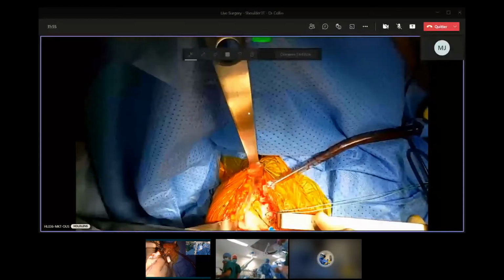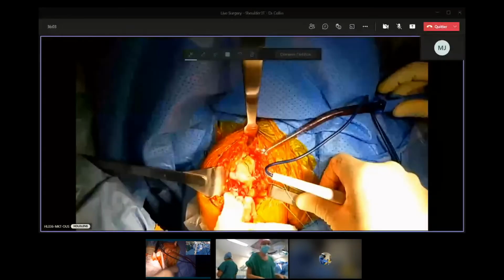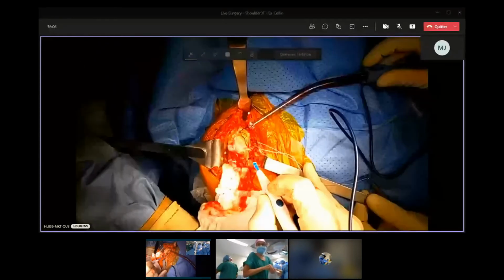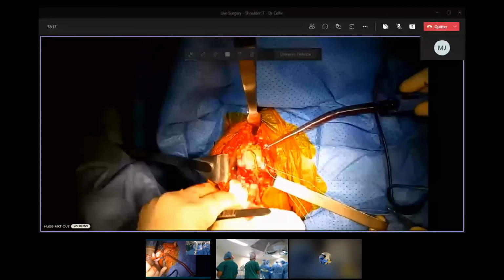And you see it's very useful to put your thread in the Three Sisters because it gives you the level, the inferior part. So I need to open my subscap up to this level. That's very mandatory. Up to the lat dorsi here.